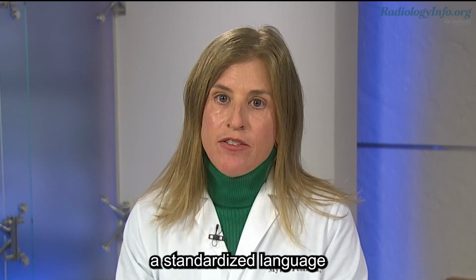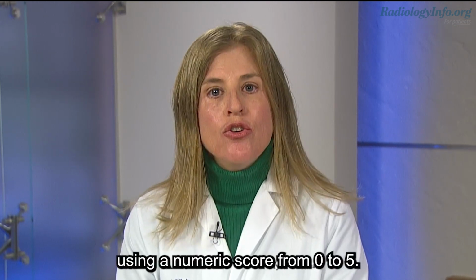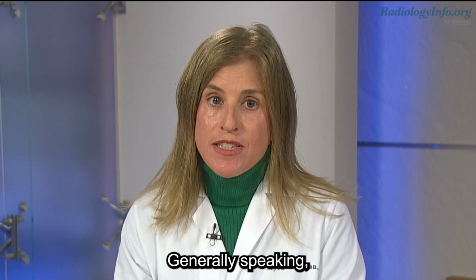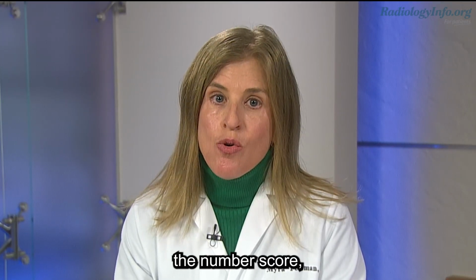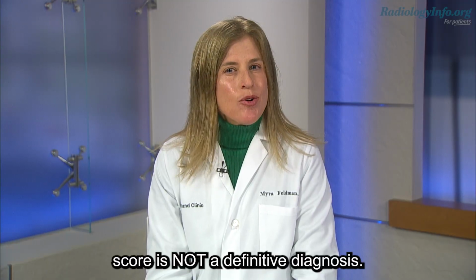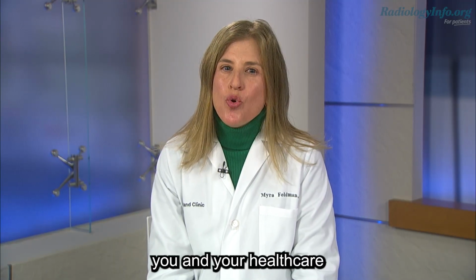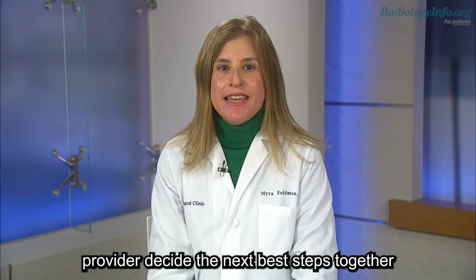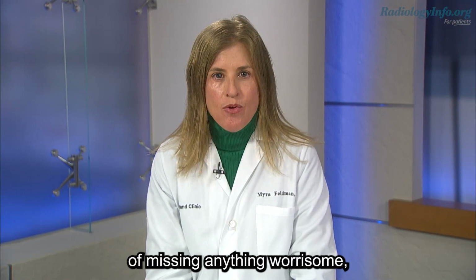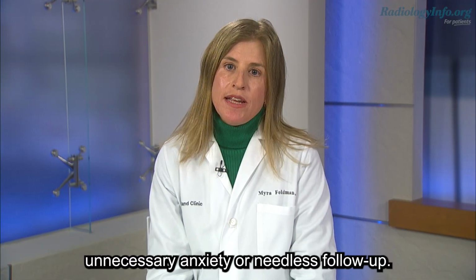O-RADS provides a standardized language to communicate a level of concern for ovarian cancer using a numeric score from 0 to 5. Generally speaking, the higher the number score, the greater the level of concern. But keep in mind, an O-RADS score is not a definitive diagnosis. Think of it as a way of helping you and your healthcare provider decide the next best steps together to reduce the likelihood of missing anything worrisome while also avoiding unnecessary anxiety or needless follow-up.